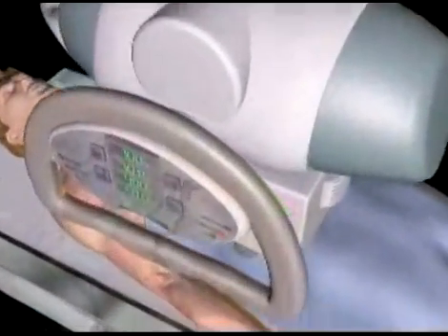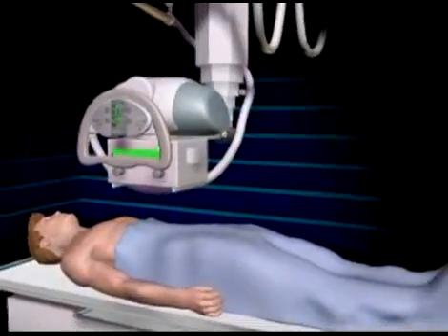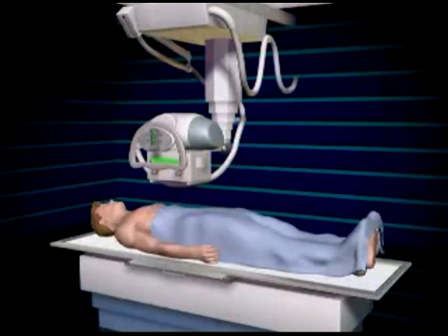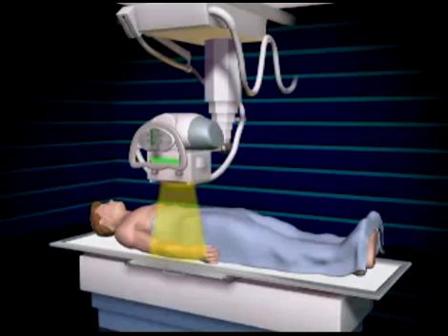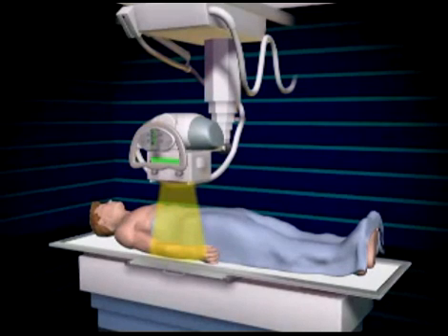The X-ray beam is a high-energy beam that can be absorbed only by dense body tissues, such as bone. During an X-ray, a radiographic film is placed behind the patient, and the patient is placed between the film and the X-ray machine. The X-ray machine then focuses the energy beam at the specific area of the patient's body.